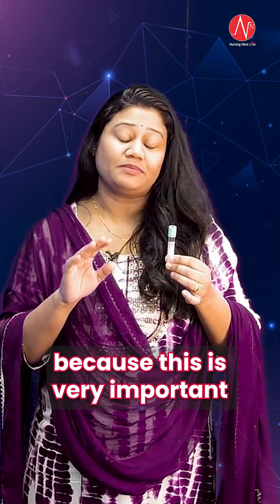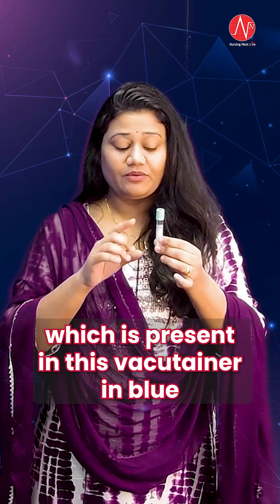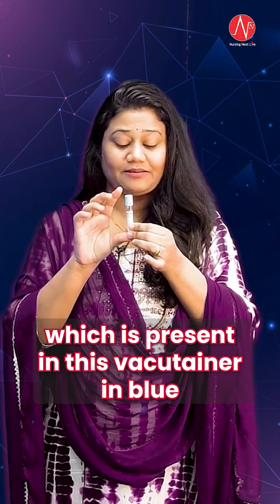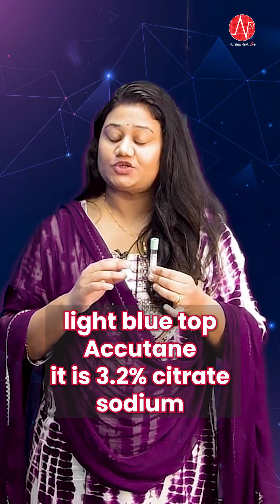You need to remember this anticoagulant because it is very important. The anticoagulant which is present in this vacu-tainer, in the light blue top vacu-tainer, is 3.2% trisodium citrate.